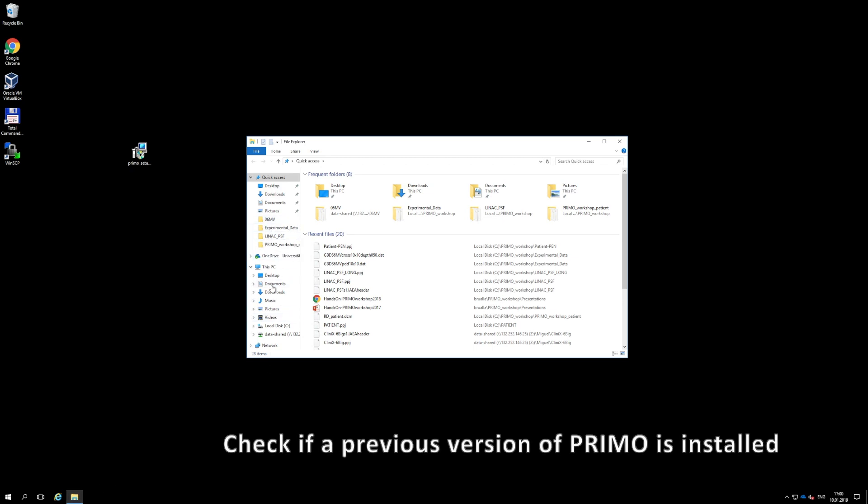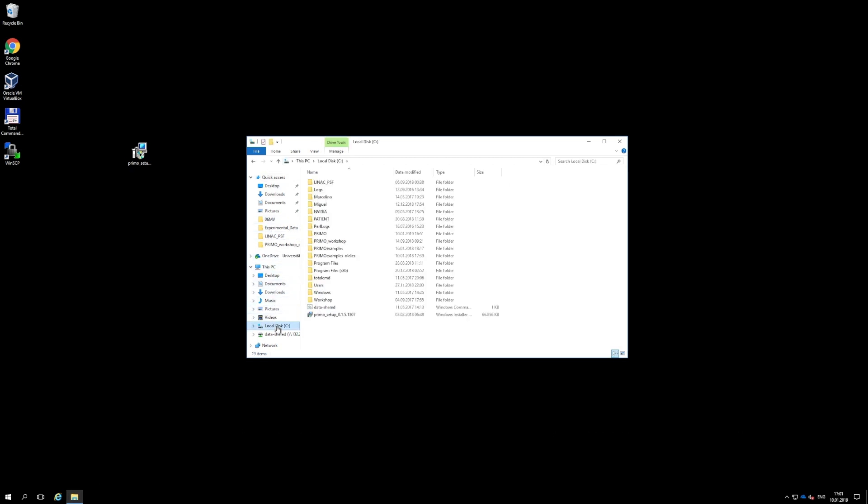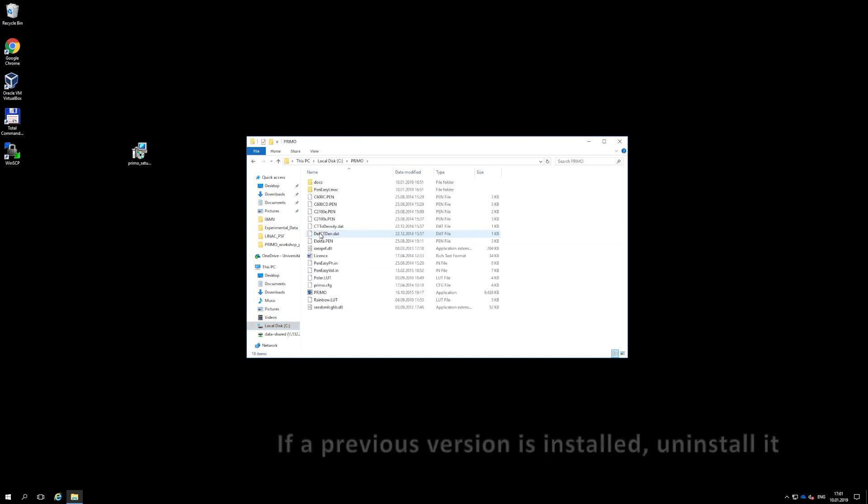Before installing Primo, make sure that any other previous version of the software has been fully removed.